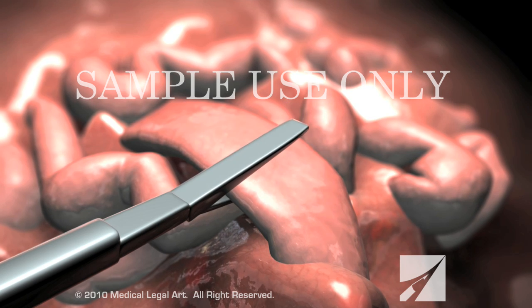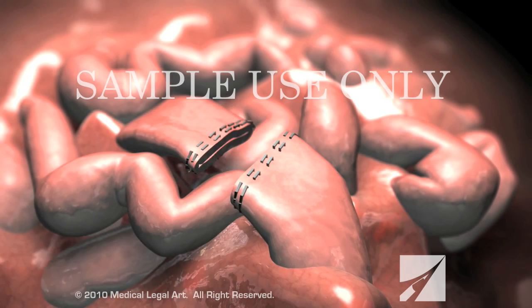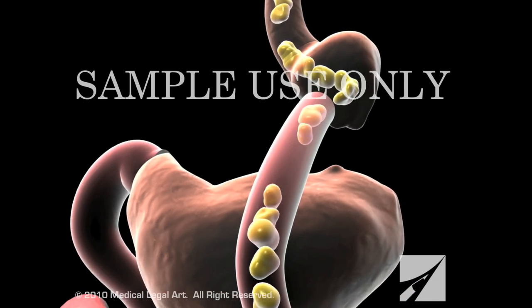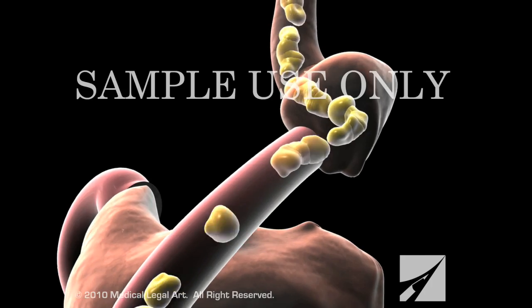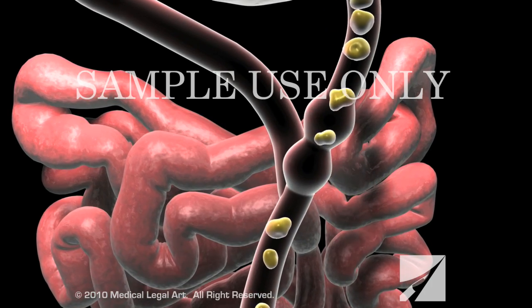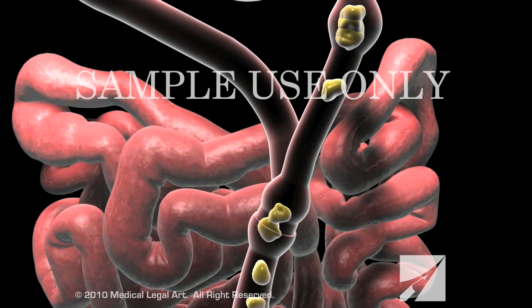Next, your surgeon will cut the small intestine well beyond the stomach and bring one free end up and attach it to the pouch. He or she will then attach the other free end lower down on the small intestine, creating a Y shape.